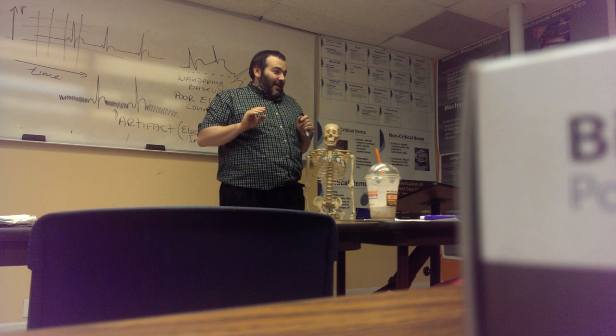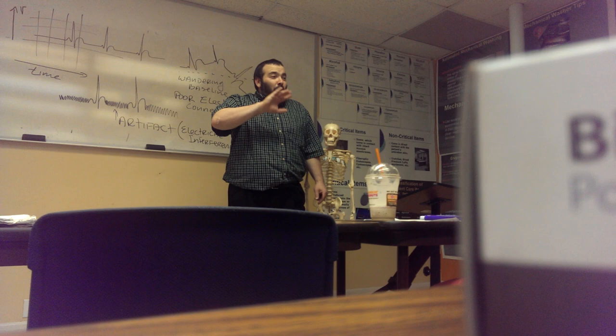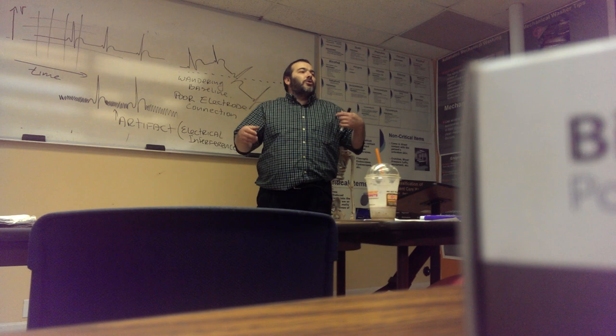All right? Does this make sense? Artifact means electrical interference. Turn everything off. Get rid of the cell phones. Fix it. If it doesn't get fixed, restick everything. Okay? But don't hand this to the doctor. If you do it twice, three times, four times, go talk to the doctor. Say, Doc, I just can't get this done. Or get another pair of eyes in there. Okay? Safe? Yes. Are we okay with this?